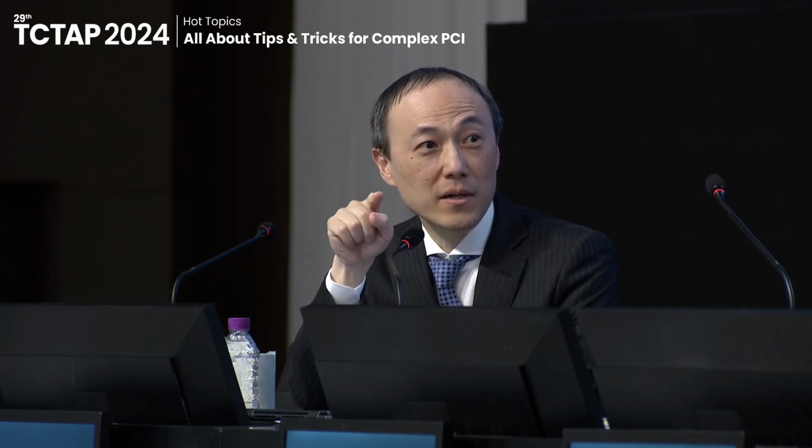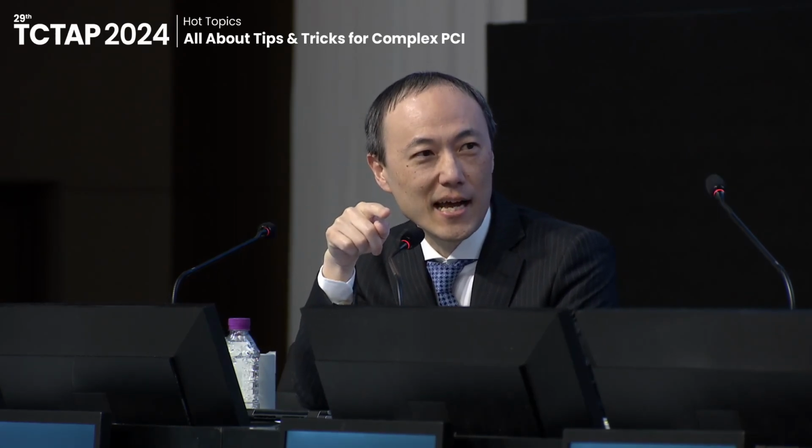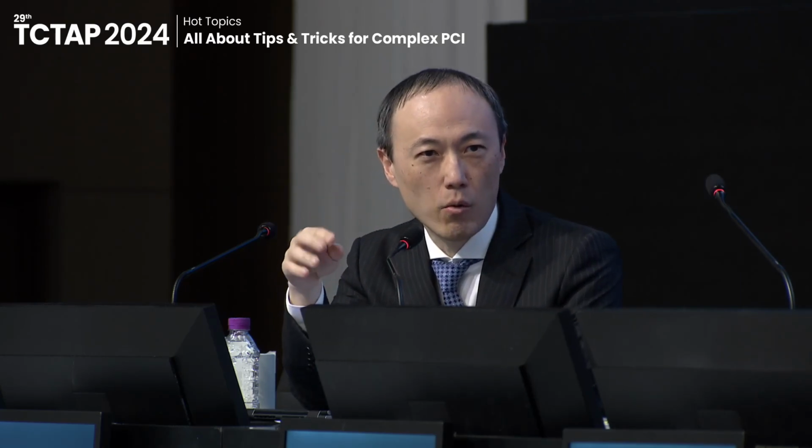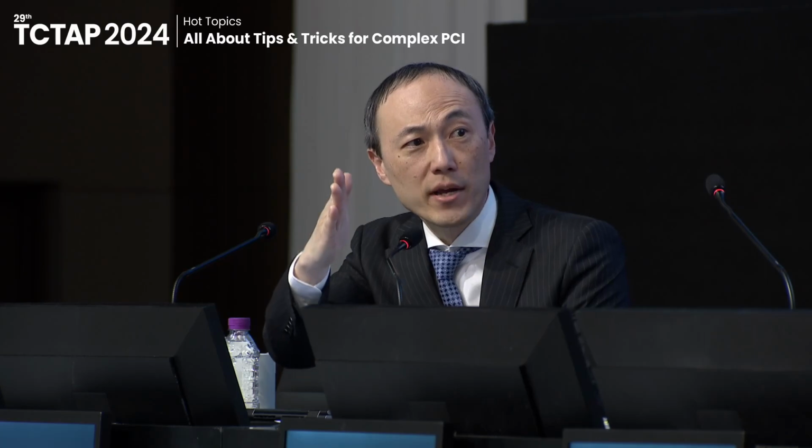Whereas with orbital, because not only does it rotate, it also orbits, I think you get 360 degrees of contact. So I think that's where the benefit is. Apart from the fact that it's much more versatile and you just push a button and you go at what amounts to about 175. But that wire bias, because with rotational atherectomy, the wire will basically go in the greater curvature. You won't have much ablation or modification of the lesser curvature.